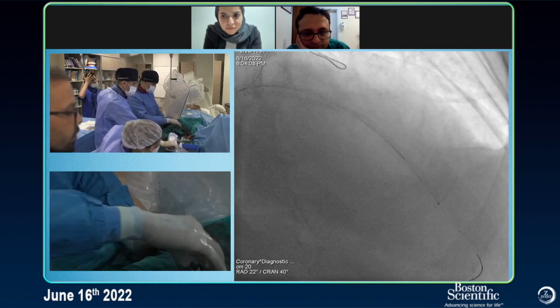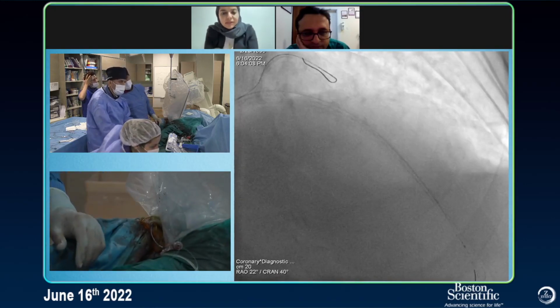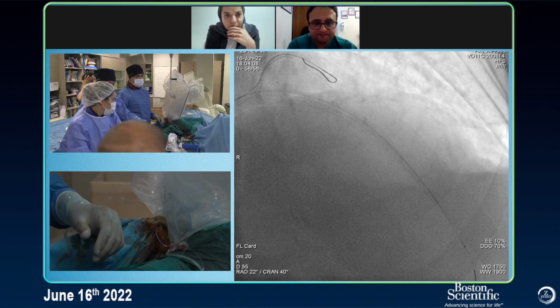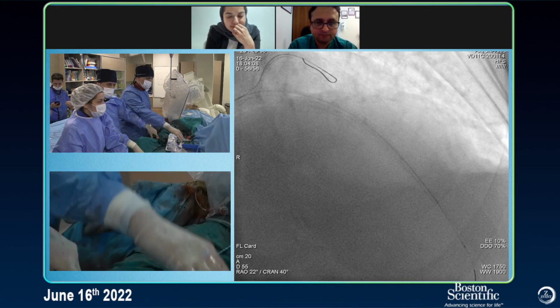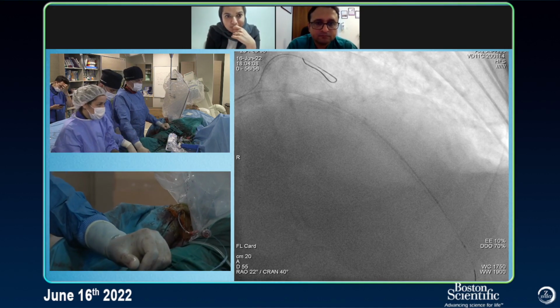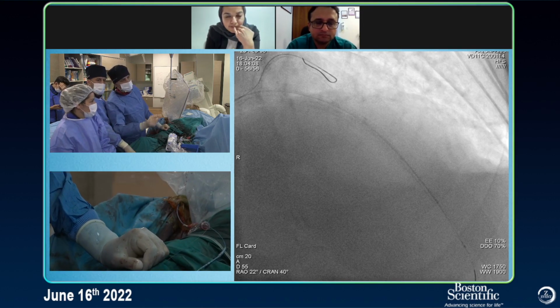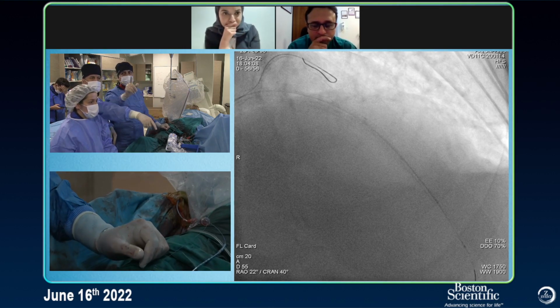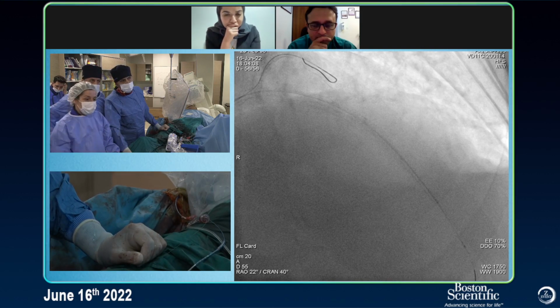Gelsene şöyle. Daha gel bir saniye. Böyle çekmeyin bir saniye. Okay, let's see. No, it is enough, if we can have the screen on the IVUS run. Oh, yes. You will see it. Ne oldu IVUS? Biz hala içerideyiz. Göremiyoruz. Ekranda bir şey yok. Okay. Pull back please, 1 centimeter. Please show the IVUS at the big screen. Su bağlayabilirler mi? 1 millimeter.